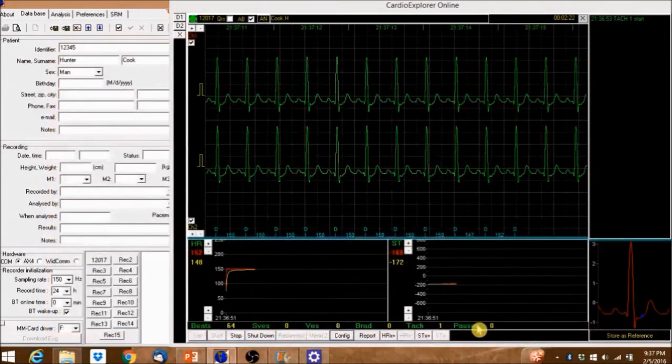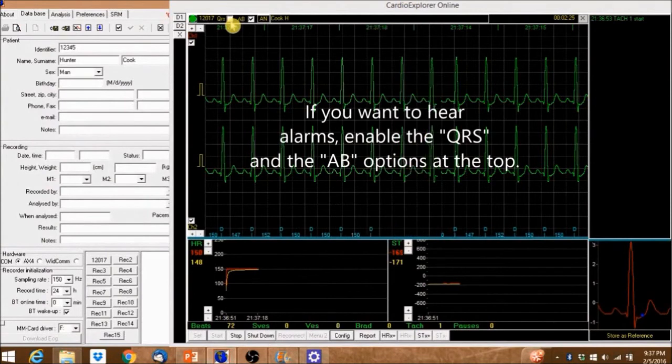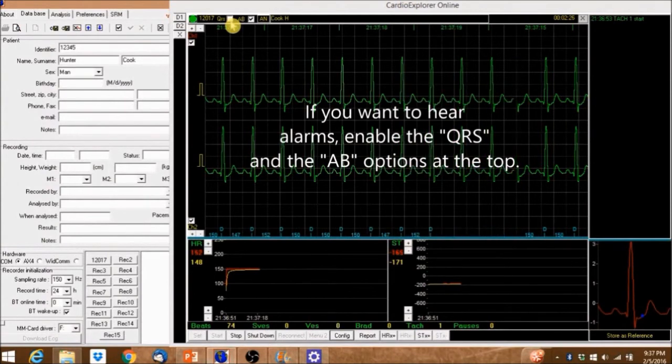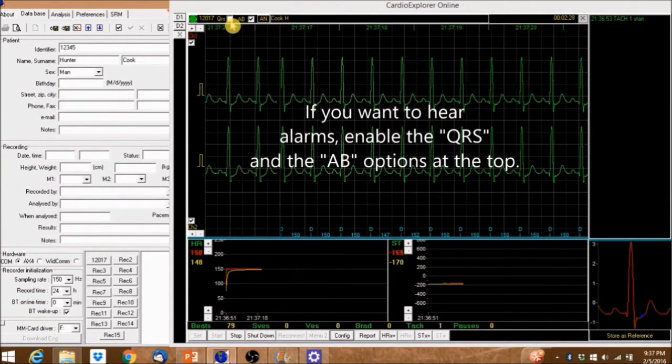If you want to hear alarms, enable the QRS and the AB options at the top.